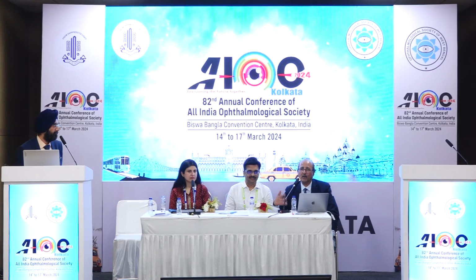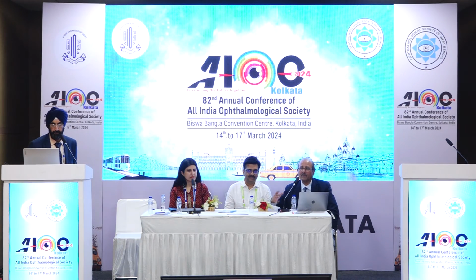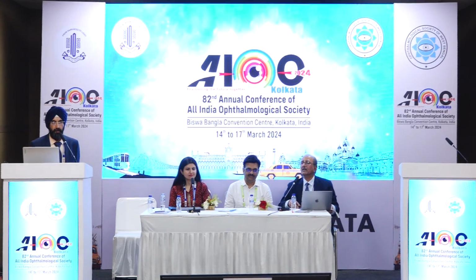Particularly the dilatation of the pupil is very impressive, and he does beautifully, I think, posterior capture. Usually we do place the IOL in the capsular bag. That is our primary approach. But recently we started doing even the posterior capture of the IOL, that is, the optic behind the posterior capsule. So he does it very beautifully.